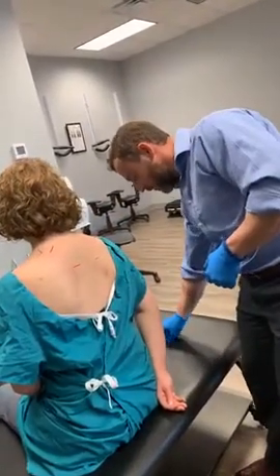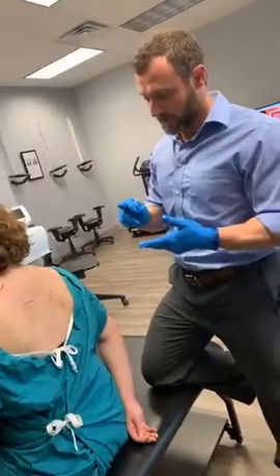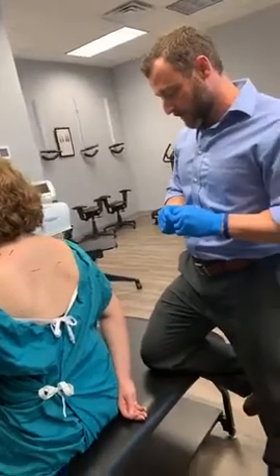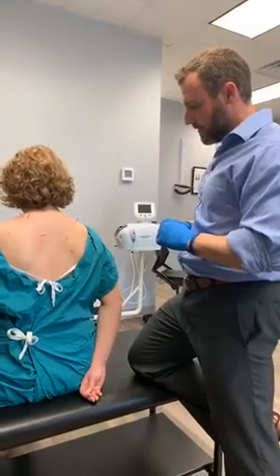So, of course, the very things that cause these knots to develop to begin with are postural, ergonomics, things of that nature. Repetitive use injuries can also contribute to knots. So we'll leave these in her for about 5 or 6 more minutes because they've been in for a little while. So that should be good.